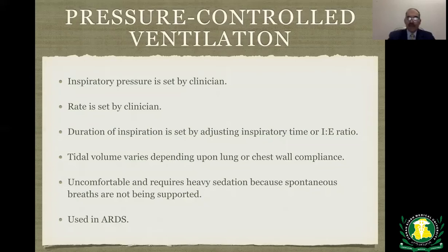It's an uncomfortable mode and requires sedation. The difference between this mode and the assist control pressure targeted mode is this. In assist control pressure targeted, whenever the patient tries to breathe, the ventilator will deliver the next breath with the set pressure. But in this, the spontaneous breaths are not supported.